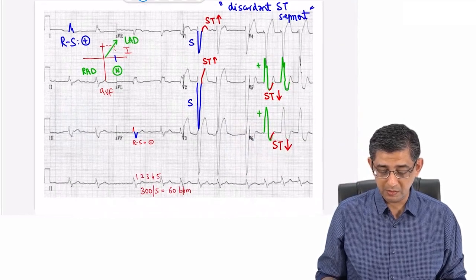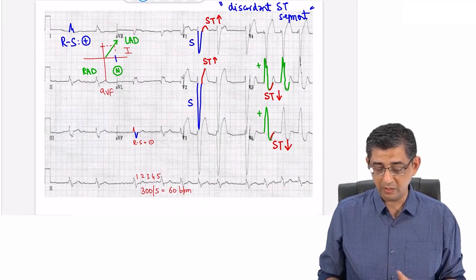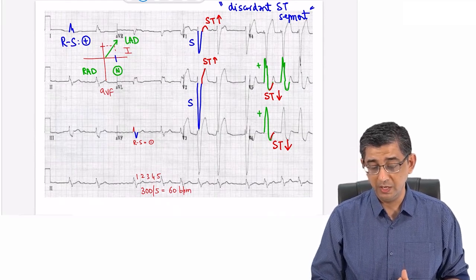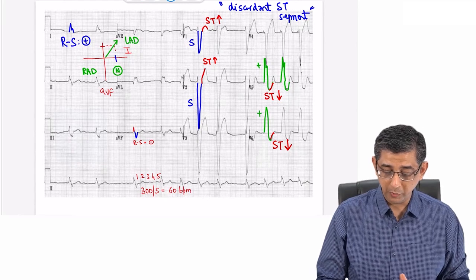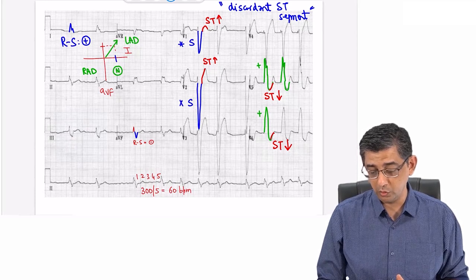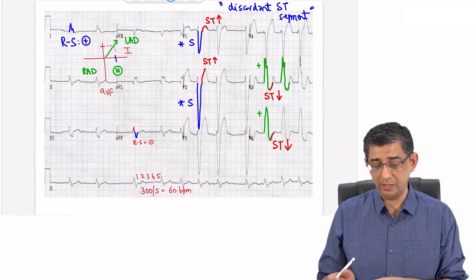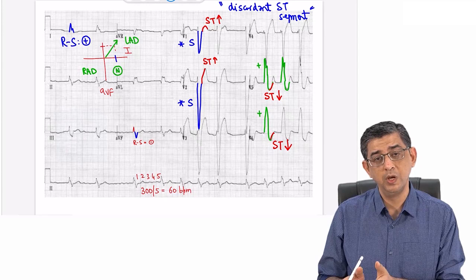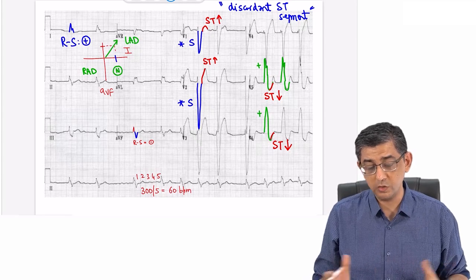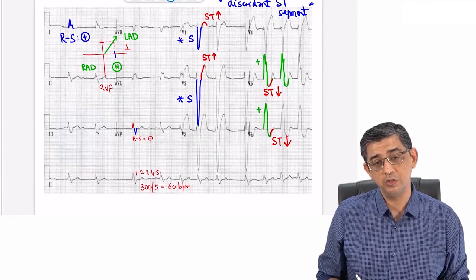So two interpretations in this case, the heart rate of the patient is varying. The heart rate is varying in the range of about 60 to 100. There's definitely an ST segment depression present. There's predominant, I said predominant, broad S waves present in lead number V1 and V2, which normally does not happen. And you can also see the progression is not occurring. Now, like I told you, the S wave is going to be deeper in V1, V2, and then gradually the height of subsequent waves will change. So the progression pattern is not exactly the same. And most importantly, discordant ST segment changes also came up.